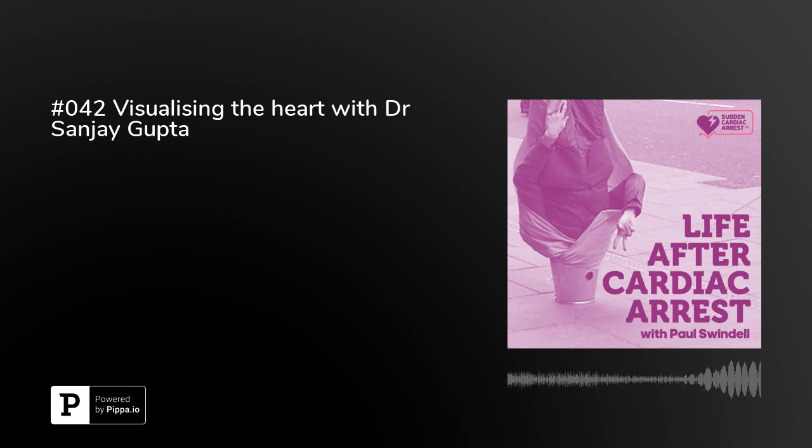With cardiac magnetic resonance, you can give a dye called gadolinium, and that can delineate scar, as it accumulates in scar. And so if you take the images and you find that that scar is involving the innermost layer, then you make a good assumption that that scar was caused by a heart attack. So with an echocardiogram, all you see is a bit that's not moving, and you assume that there's been damage. But what we don't know for sure, and sometimes we cannot be sure, is was that because the person had had a heart attack?